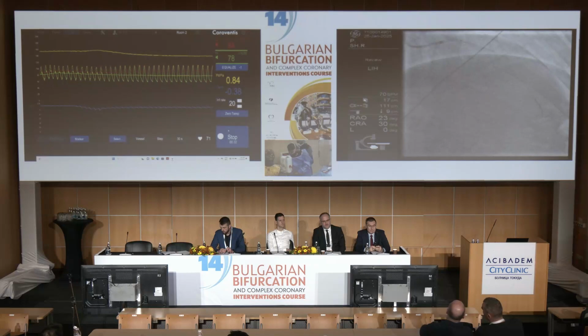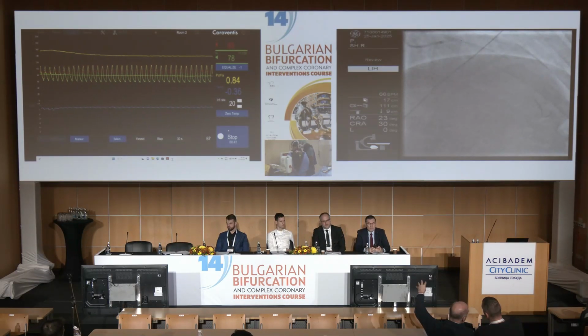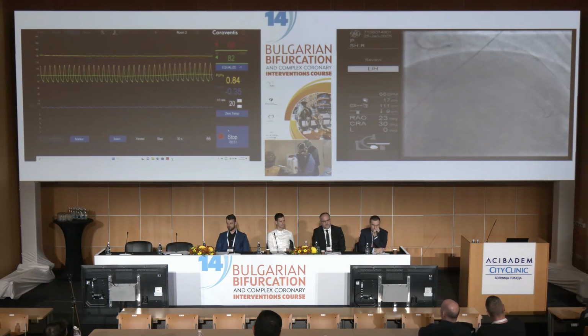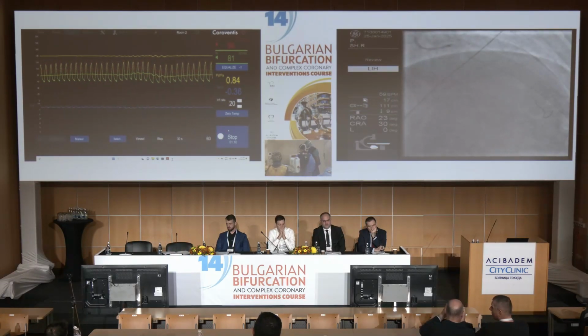And this is actually hyperemia. You are going to say, hyperemia, what do you tell us? Because we are not using papaverine here. Well, no. We know that administrating 20 milliliter per minute of saline through these lateral side holes induces the nicest steady state maximal hyperemia that you can dream of. And you see that all these numbers are extremely stable. There are some oscillations of the signal, but that's normal, that's the phasic flow. But on the average, it's very stable.